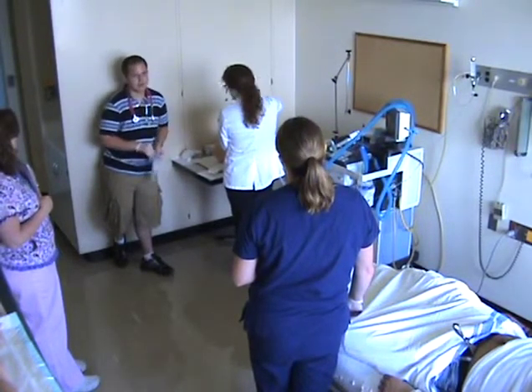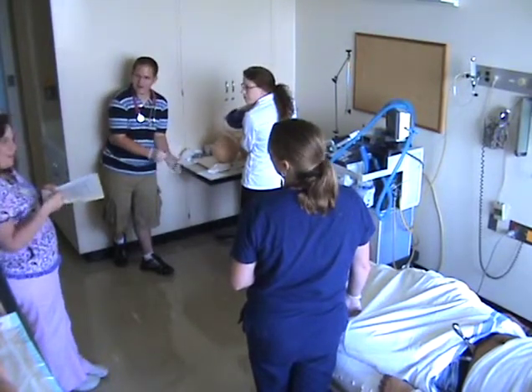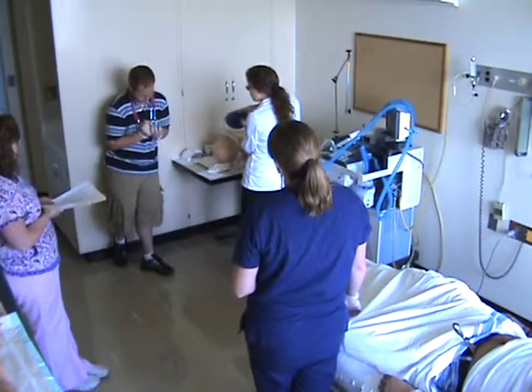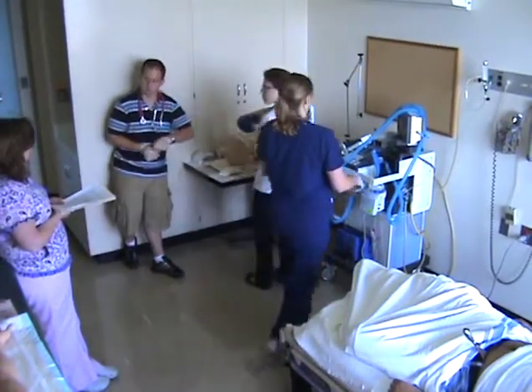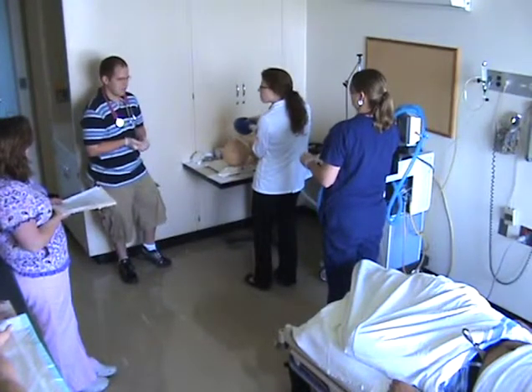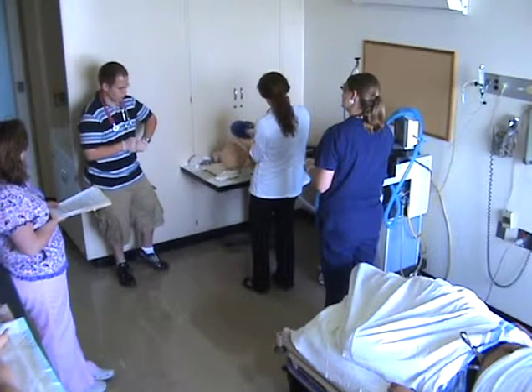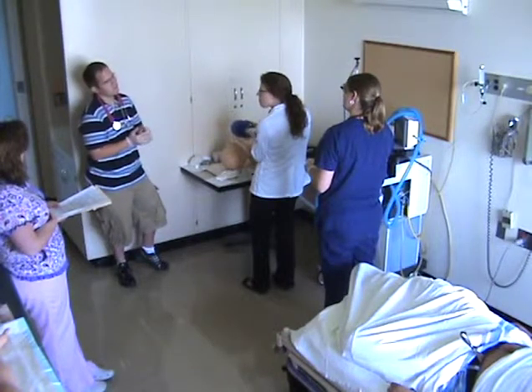Are you okay bagging? Yeah. Okay. And unfortunately, in real situations, people would be doing other things, we're just following through that. You have to do the A and take care of the B before we go to the C. That's good. Actually, I'd say about 800 tidal volume. Okay, a little larger. 800 tidal volume, a rate of 12 to 20, PEEP of 5, FiO2 of 100 because he's in respiratory distress. And let's do volume controlled AC mode.